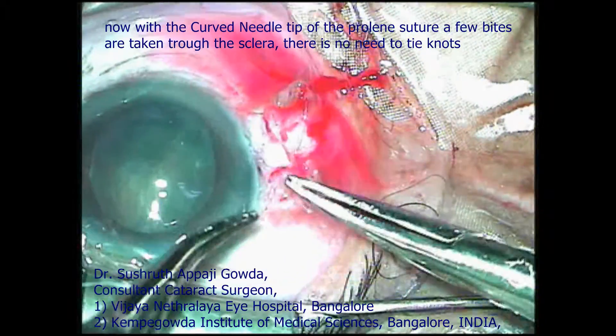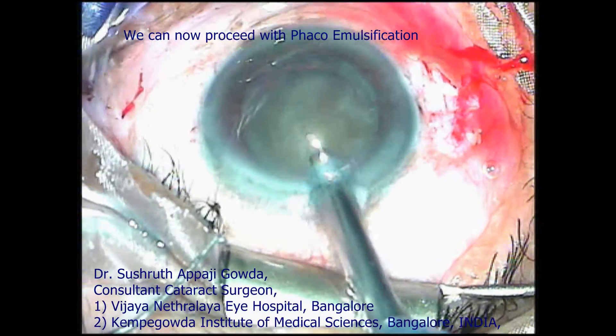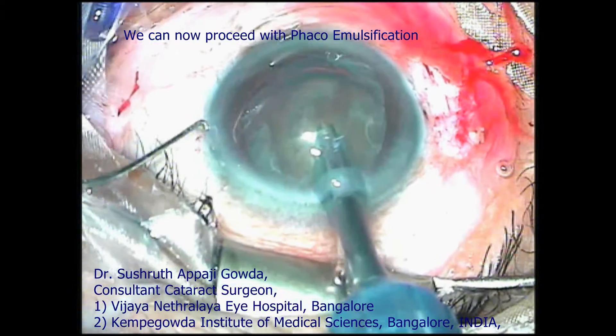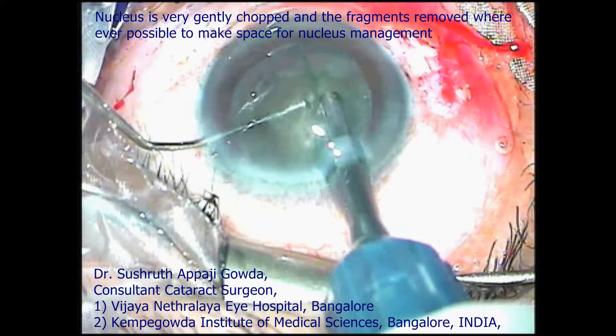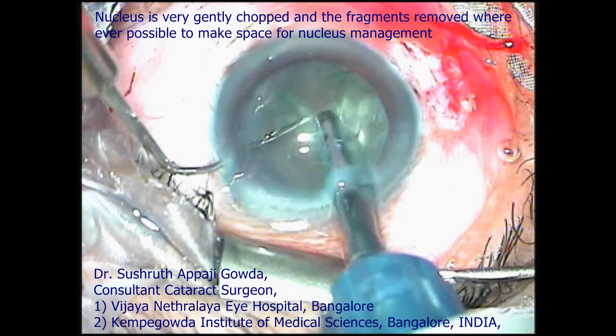After this, we can proceed with phacoemulsification. Very gently, we bury into the nucleus and the cataractous lens is broken into very small fragments. These small fragments can be aspirated very slowly, making more room for manipulation.